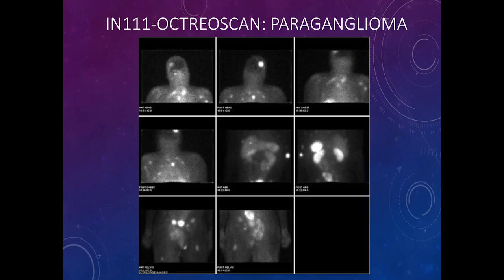I think I remember this patient. It was a young girl, and she had this humongous mass in the pelvis. She had those bumps on her head. And overall, this tumor was not really growing at all for many years, even though it was metastatic. It was quite an interesting case.